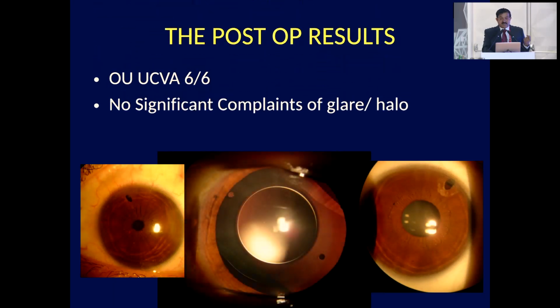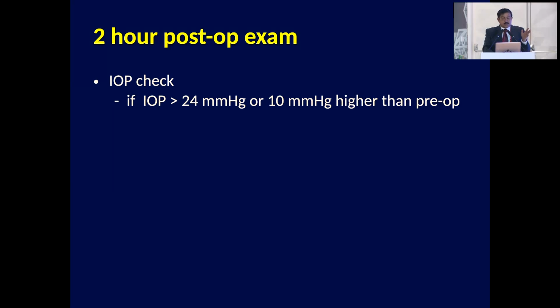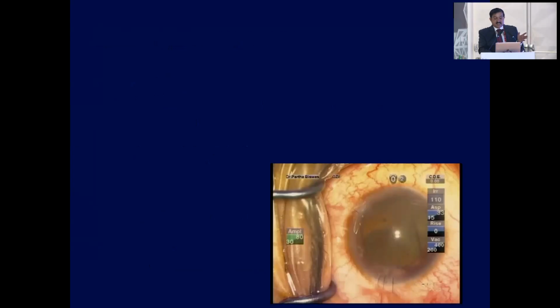The post-operative results are usually very good. Glare and halos, if the patient complains, just let time go for neuroadaptation for that. Usually they adapt very well. The IOP check has to be done. There can be IOP elevation and the ICL vault.